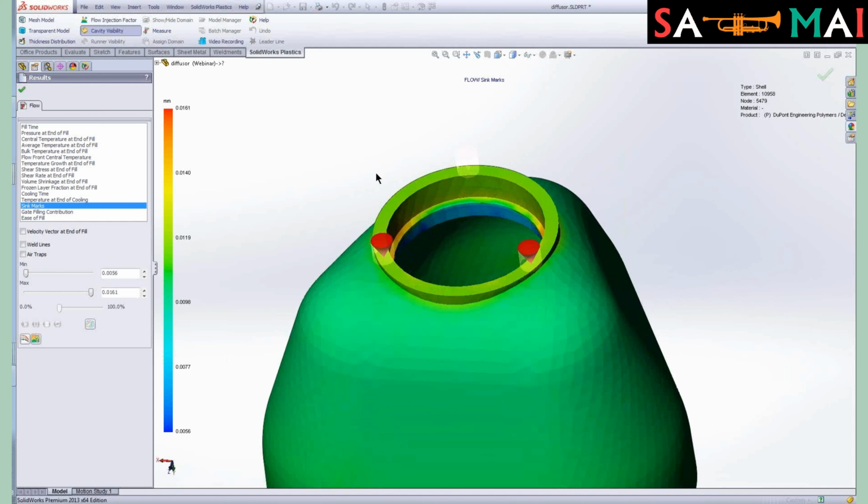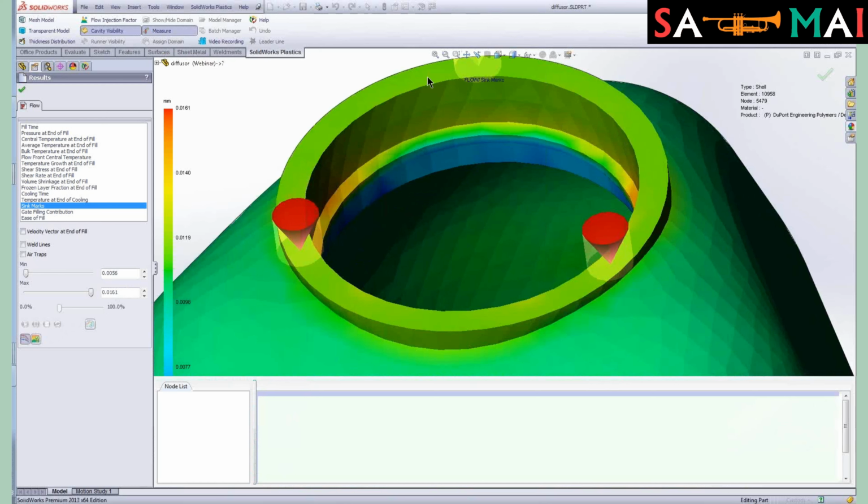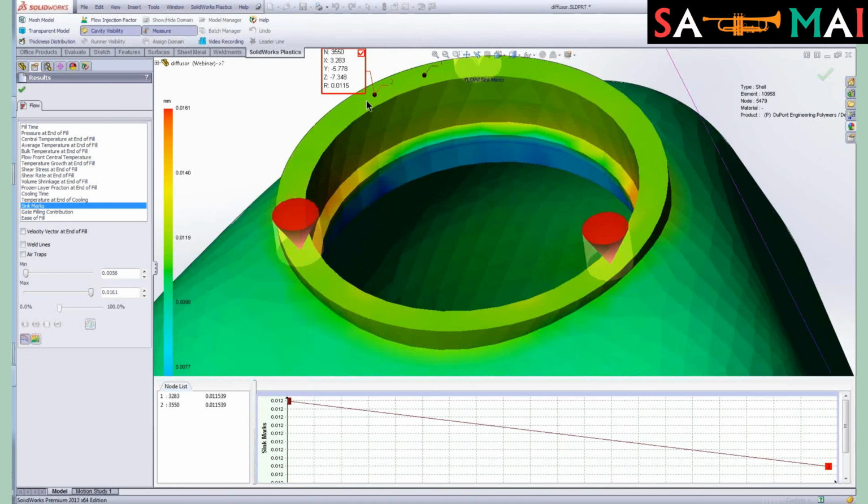Let's say, for instance, you have a metrology department or someone that needs to measure the flatness of that top surface of the part. What I'm going to do is go into our measure tool. I'm actually going to turn on an XY plot. What I'm going to do is pick a few locations around this face.